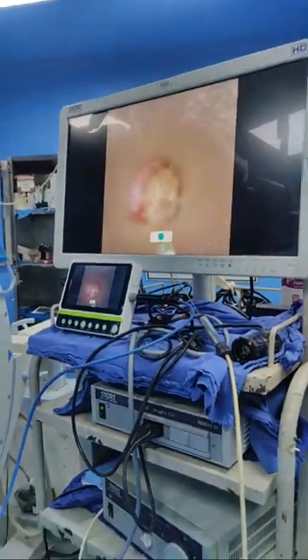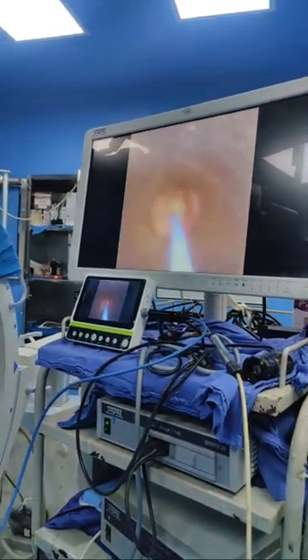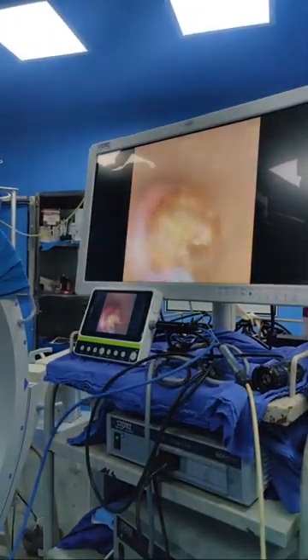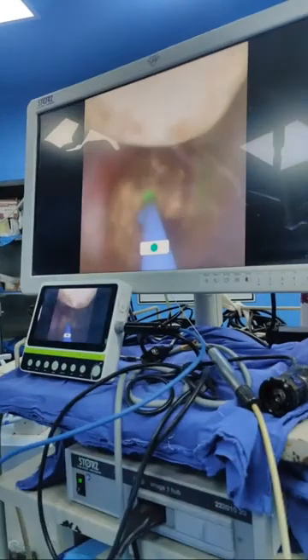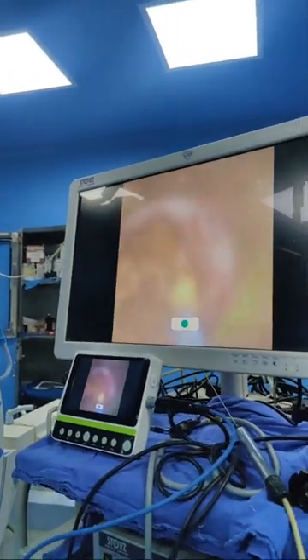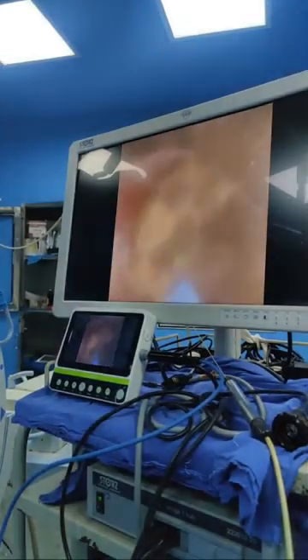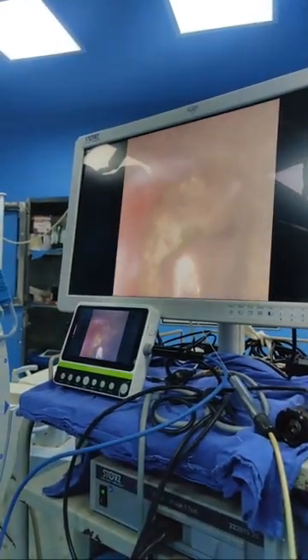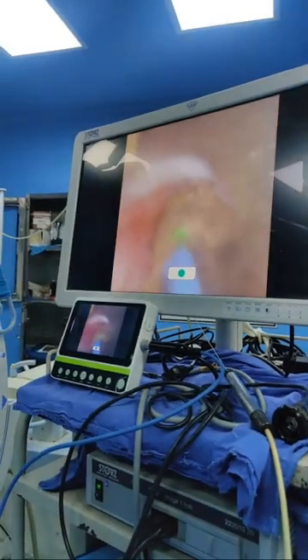So this is almost, we have removed all these fragments without any forceps. This is just by suction. And the laser fiber is coming from 6 o'clock to the center. So whatever picture you are seeing in the center, it is there. So the precision of energy delivery is extremely high in this nephroscope. There is no replica of the nephroscope at all. He is very precisely touching the surface. He is breaking the stone from the center rather than from the periphery. Can you see the precision? The fragment is gone.